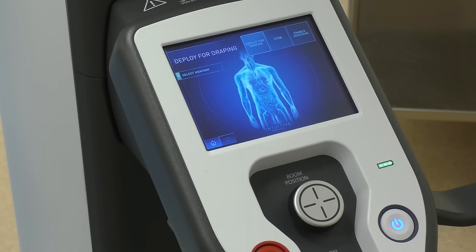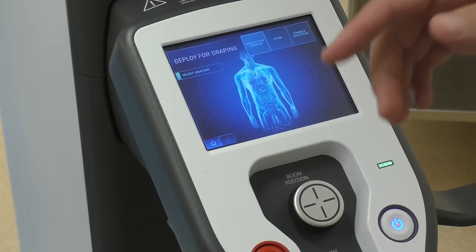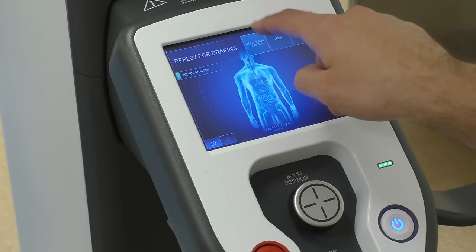As a tech, obviously you want to set up your robot to be able to drape it. What's nice about the XI is it has a button that says 'deploy for draping' and it will open up the arms and position them in a way that you'll be able to drape it easily. So let's do that right now.